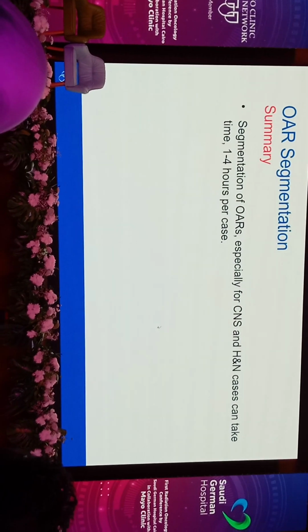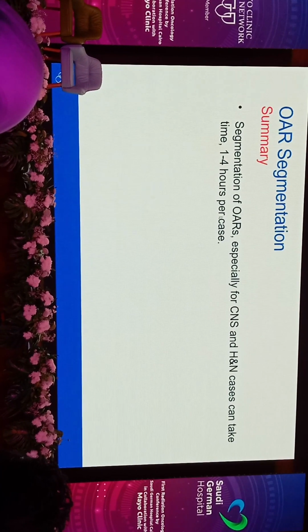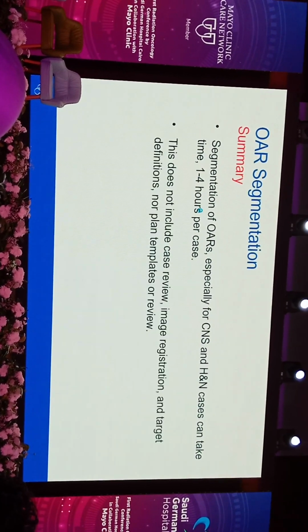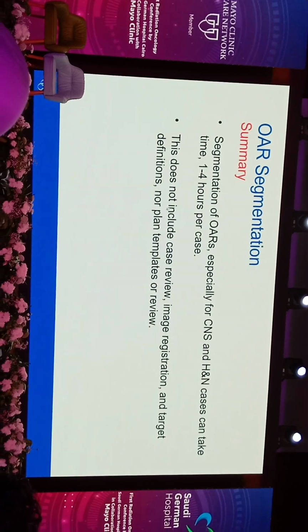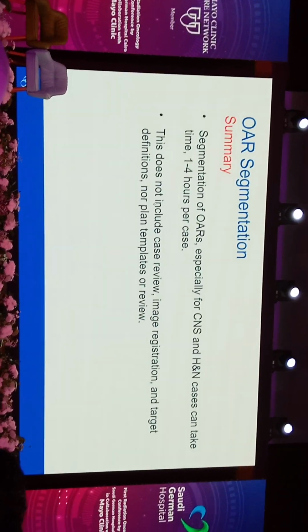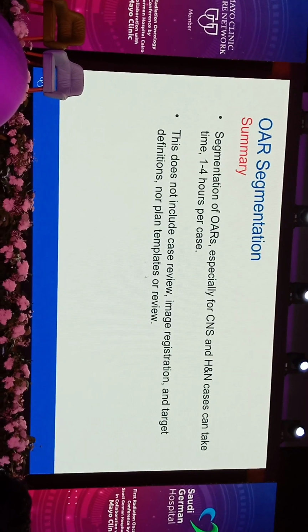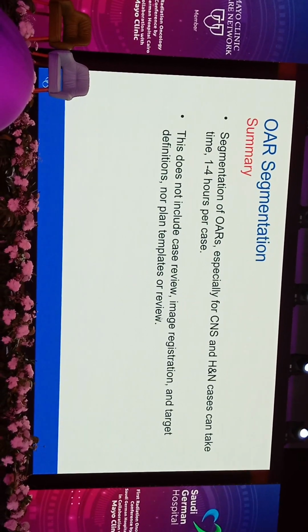So in summary, segmentation of OARs, especially for CNS and head and neck cases, can take time, 1 to 4 hours per case. This does not include the case review of the patient situation, image registration, target definitions, entering a planning template, or a review of the treatment plan.